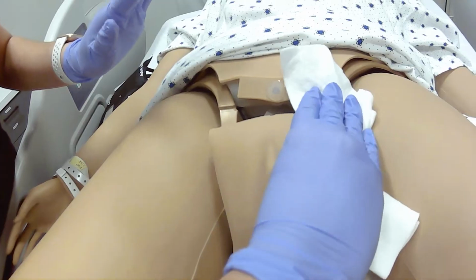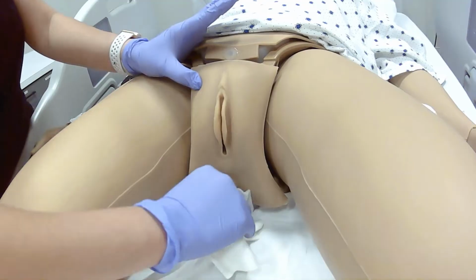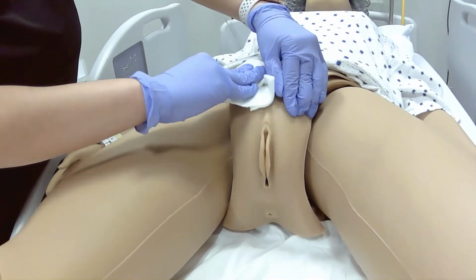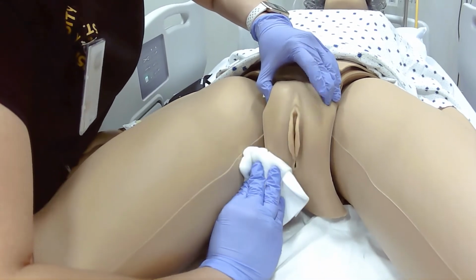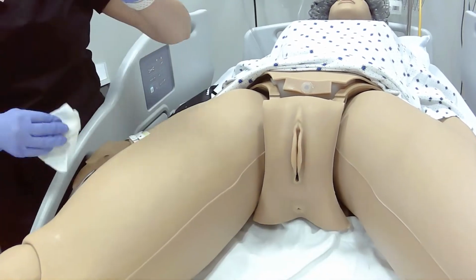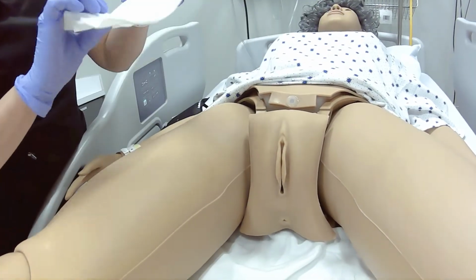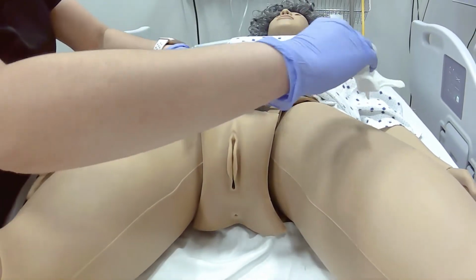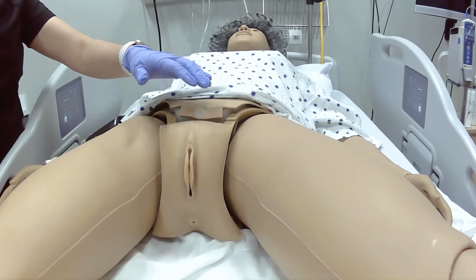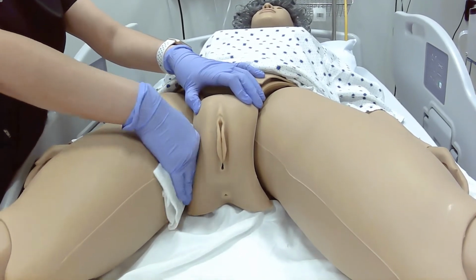So now I'm going to clean down from top to bottom, down the groin, okay, new wipe, top to bottom, down the proximal part of the groin. So top to bottom, so down to the buttocks, okay? And then I'm going to get a new wipe and then clean the upper thigh, top to bottom, okay? Get a new wipe. Now it's going to be the proximal upper thigh, top to bottom.